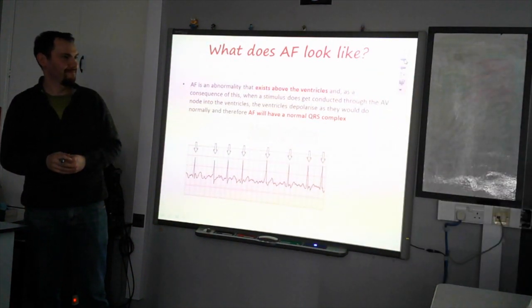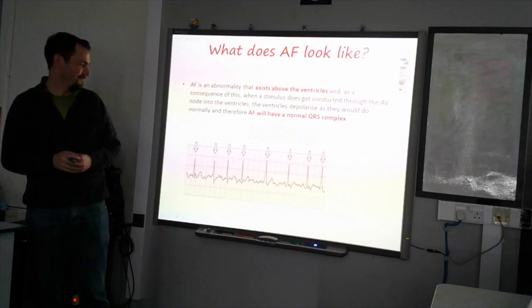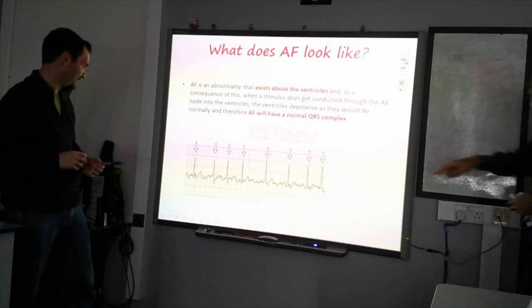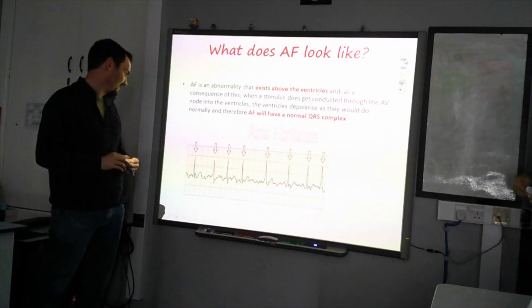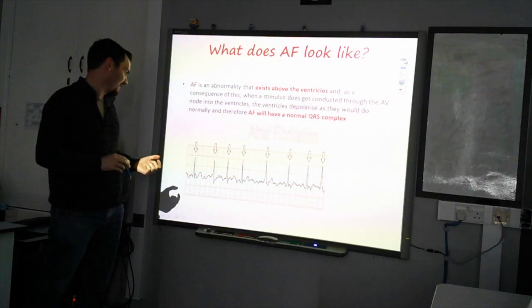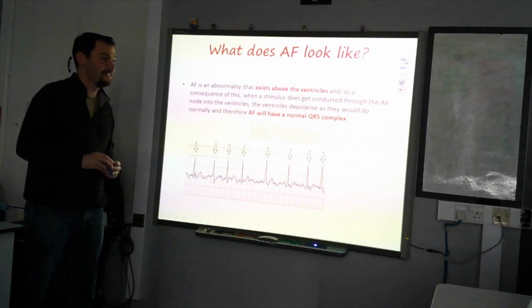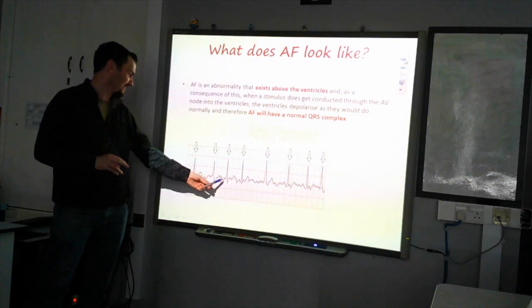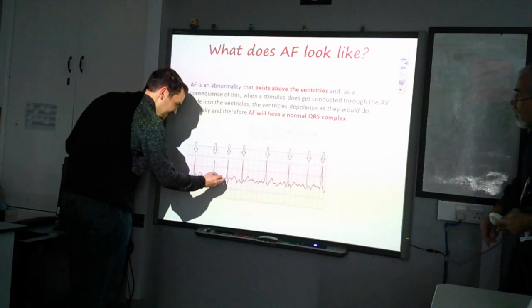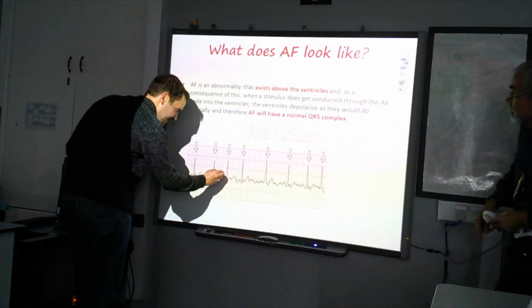Now, Phil, can you show us where those lovely F waves actually are? Can you give us an idea as to where they are? We know the tall ones are Q, R and S. So where do you think the F waves might be? Is this still a T? There's no T in that, is there? Correct. So if you just draw a little line, Phil, to show me where you think those F waves are. Yeah, just like a bracket.